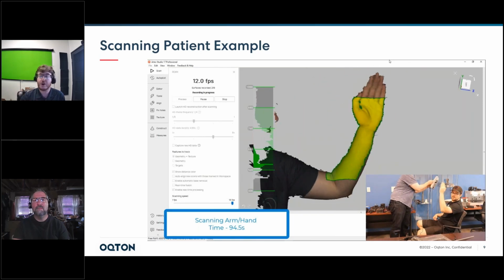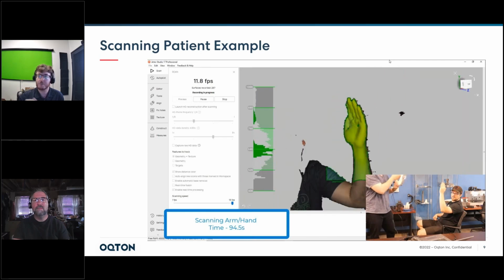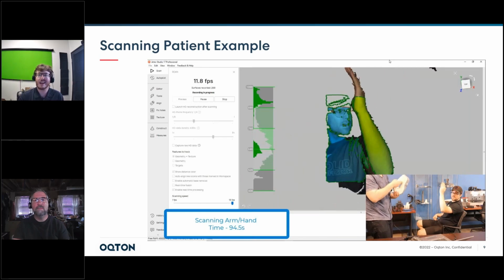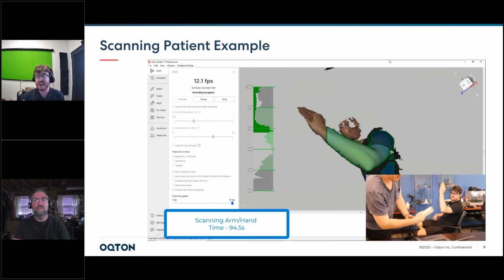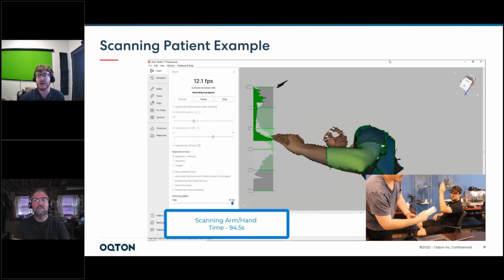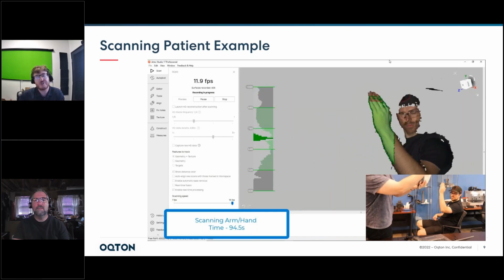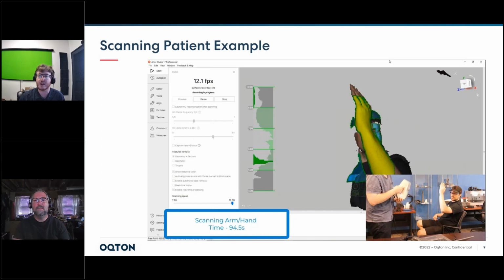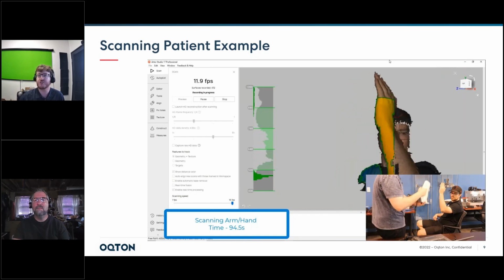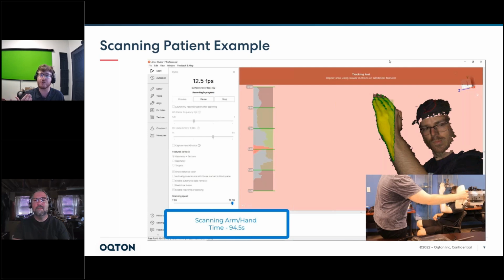So this is an Artec Ava. This is one of those structured light scanners, and it's scanning at 12 frames per second. Every time you see it flash, it's taking a photo of the person, and it's trying to match that photo to the next one, creating essentially a panorama of the person, which we see represented in the software right there. The different colors are just our offset distance, so we're making sure we're at a good distance, not too close to the patient or too far away.